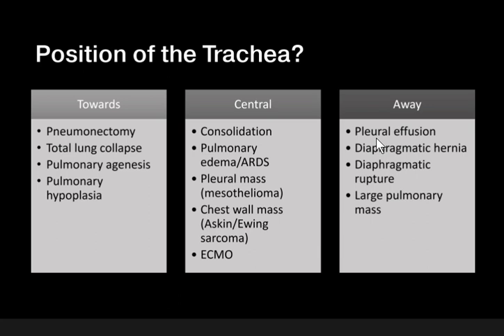What else? Subpulmonic effusion. We get radiographs that have asymmetric domes of the diaphragm. The right diaphragm is excessively higher than the left, or the other way around. Try to give the differential of subpulmonic effusion, and proceed to ultrasound.